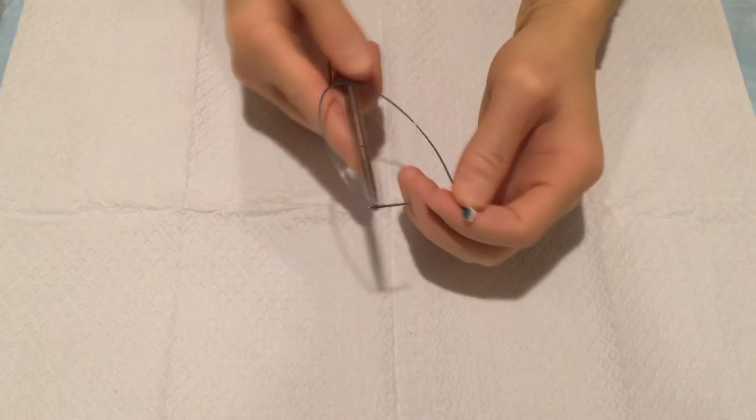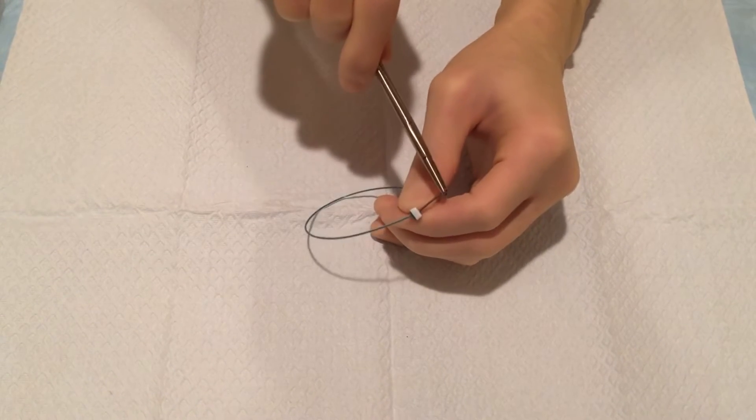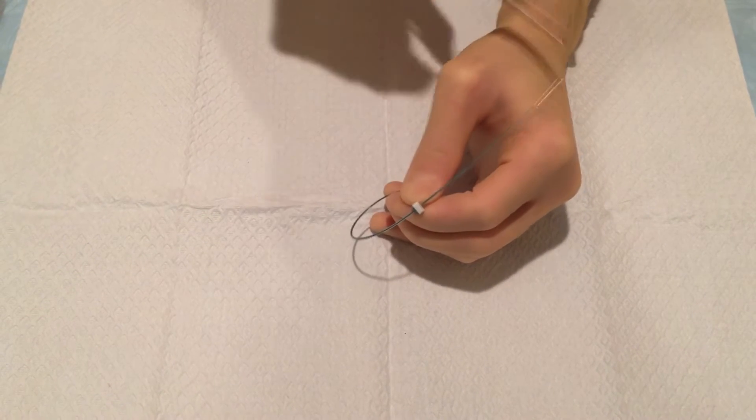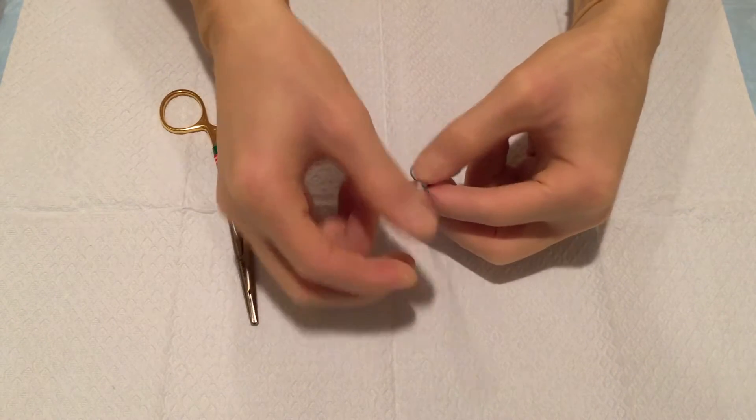The needle segment of the device features a blunt tip needle which prevents needle stick injuries. The device forms a strong secure loop that can be easily tightened but will not loosen.